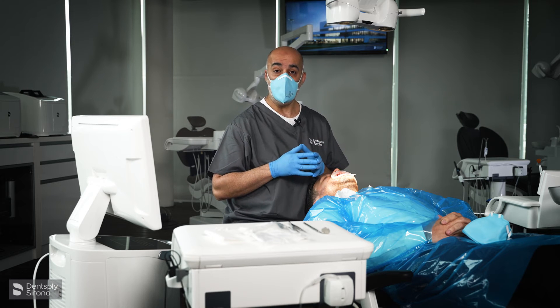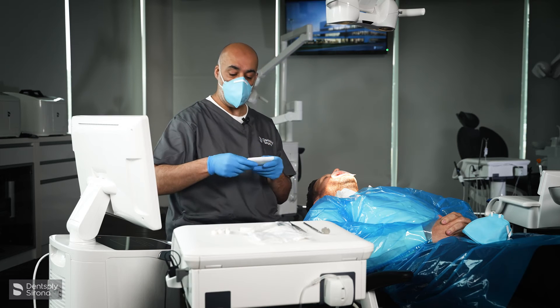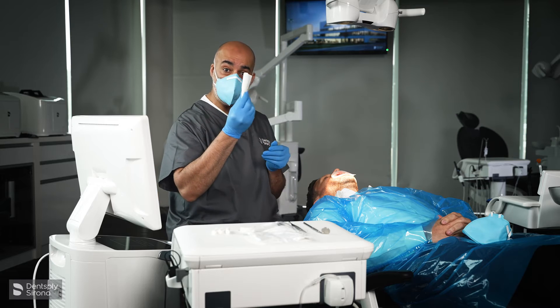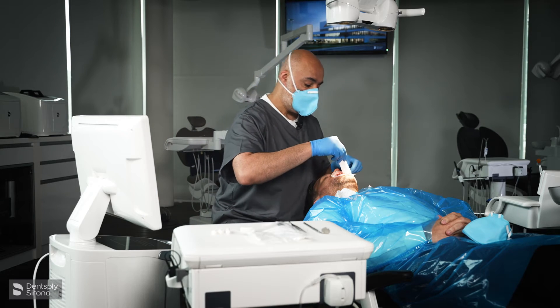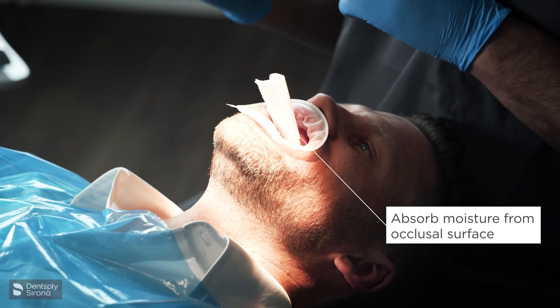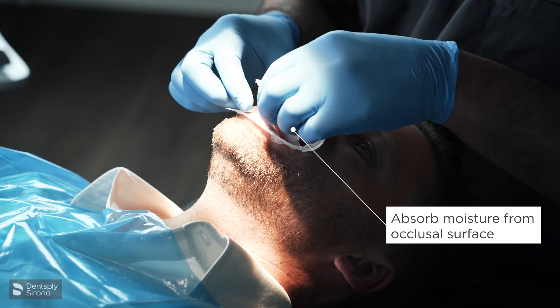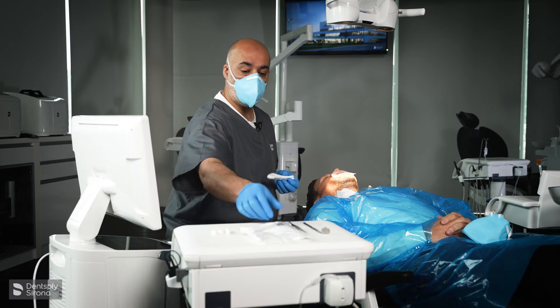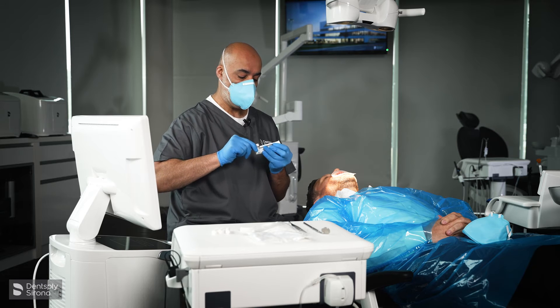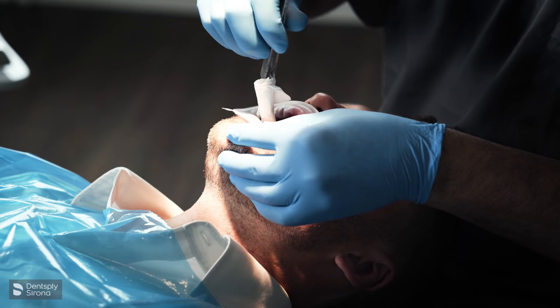We need to dry the teeth now. I don't use a three-in-one because I don't want to generate any aerosol, so I will simply fold some tissue. You can either just drop it into the patient and ask them to bite — open nice and wide and bite together — and that will start to absorb some of the moisture over the teeth. You can also use Miller's forceps, simply attach the tissue to that so it becomes one piece, and you can do it on both sides.